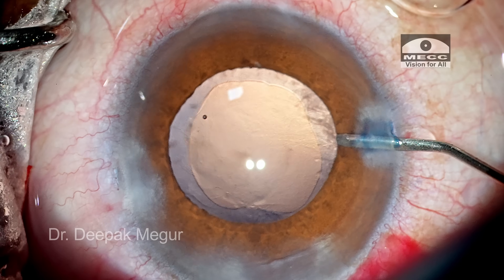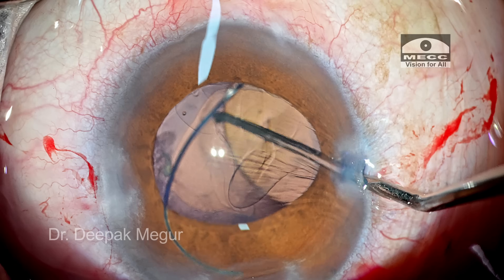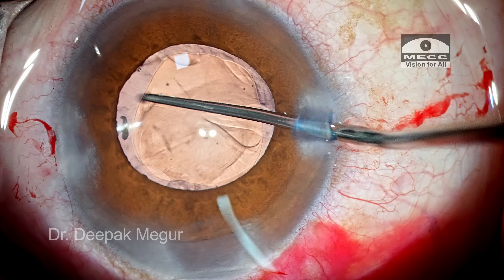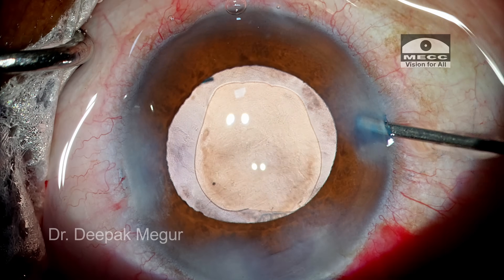The cortex aspiration is done. The chamber is filled with OVD and the intraocular lens is implanted into the bag. The OVD both in front of and behind the lens is aspirated. The case is done.